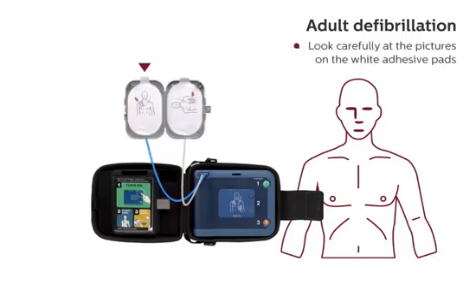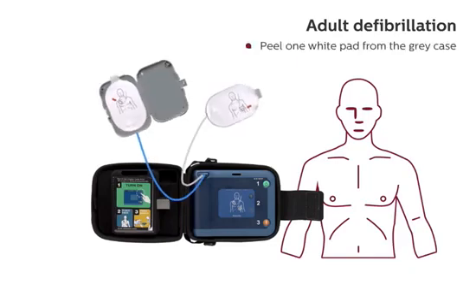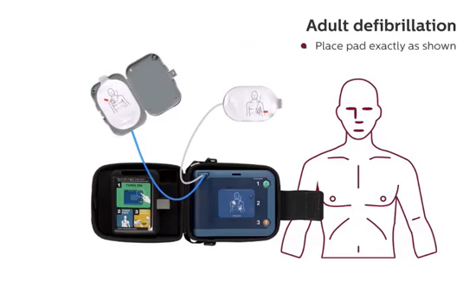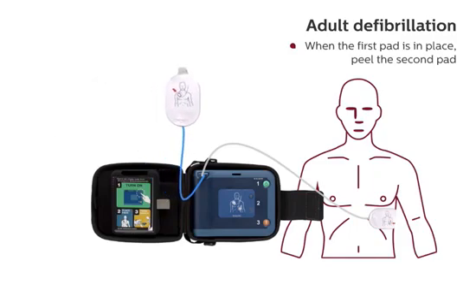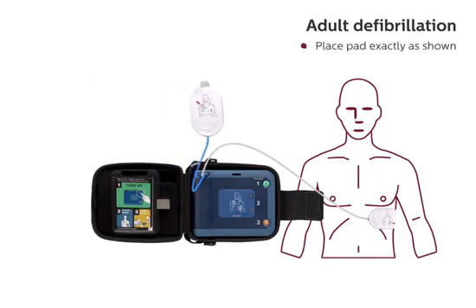Look carefully at the pictures on the white adhesive pads. Peel one white pad from the gray case. Place pad exactly as shown and press firmly to bare skin. When the first pad is in place, peel the second pad. Place pad exactly as shown and press firmly to bare skin.